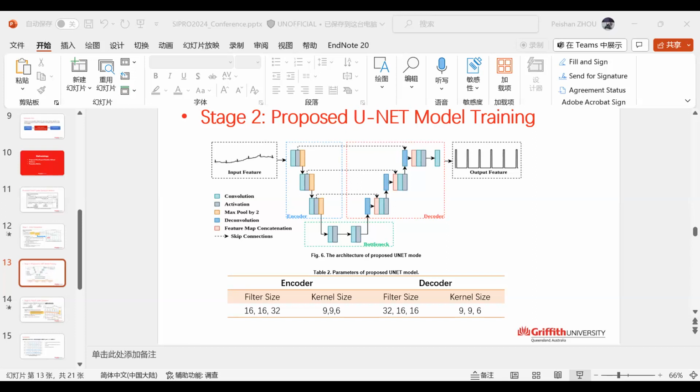Here we do want to mention the proposed UNet also shows an improved resistance to noise. Here's an example showing noise spikes that exist in record R08. For this abnormal morphology, the two traditional methods make wrong predictions or even miss the beats.